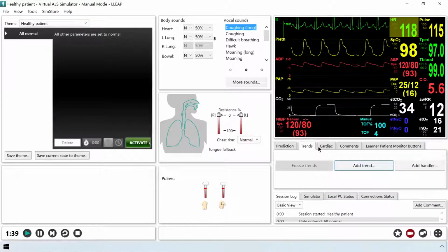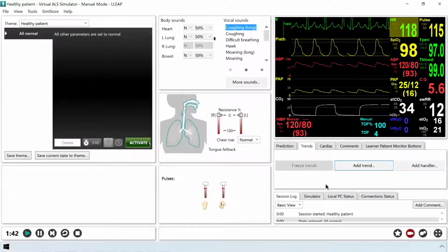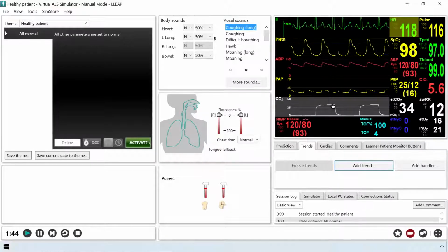If at any time something, my goodness, this is so weird on this resolution of a screen. They really need to work on this.